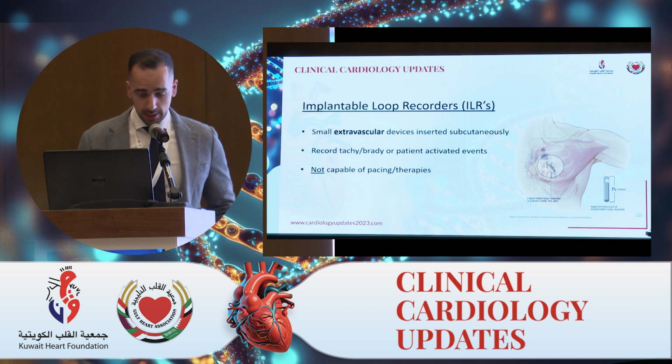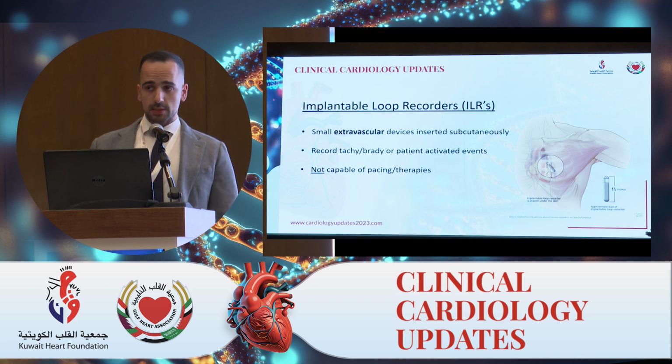And finally, implantable loop recorders, as I mentioned, are purely monitor devices. They are not capable of administering any therapy. They are small, extravascular, inserted subcutaneously, and will record any significant brady or tachycardic events, as well as patient-activated events. And these can last up to 2 to 3 years and are very helpful for patients who have very infrequent symptomatic episodes that you are concerned could be arrhythmic in etiology.